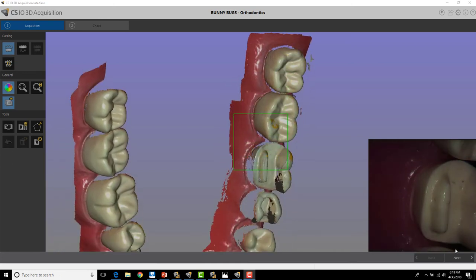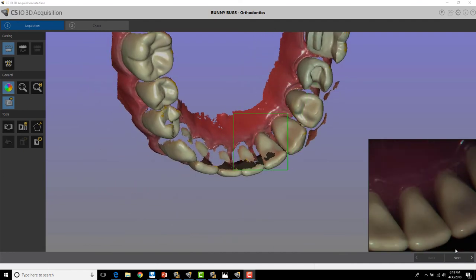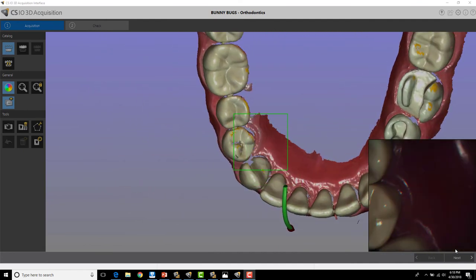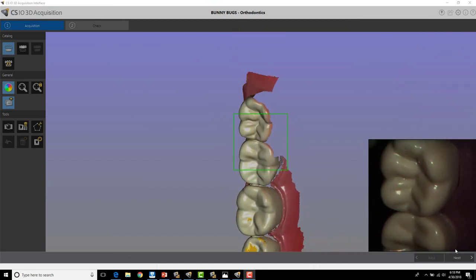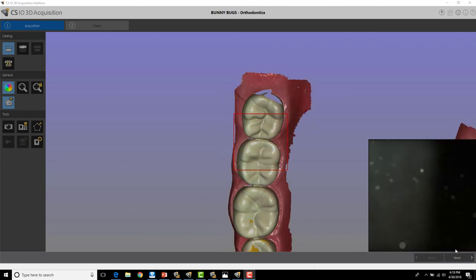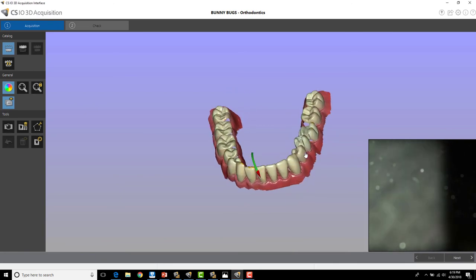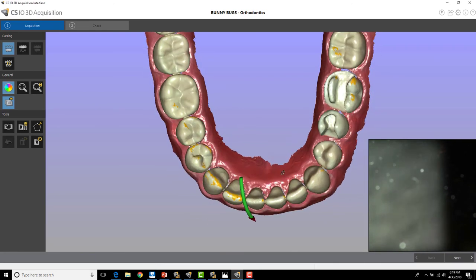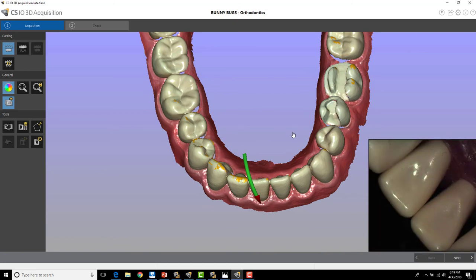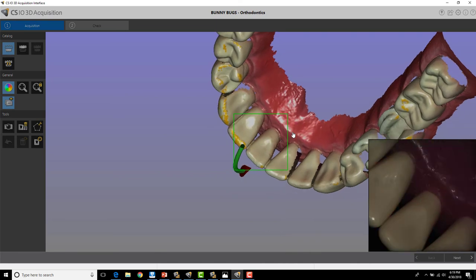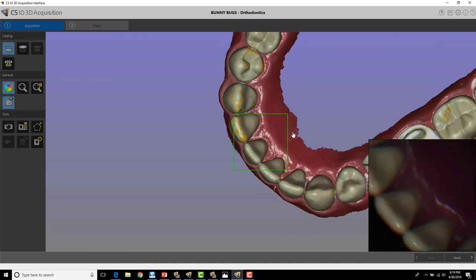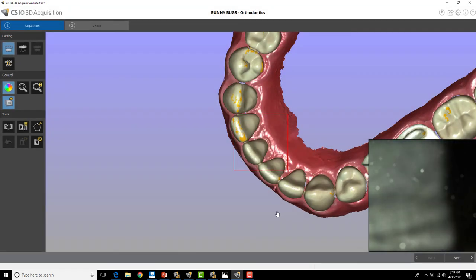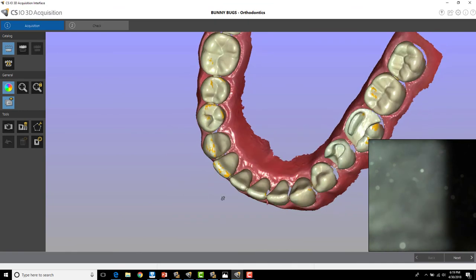And work my way around to the lingual. You might still get an arrow or two, but at least you're not getting six or seven arrows. Very easy to clean up. And you'll notice when I zoom in, even as it is, the incisal edge is really nice and smooth and clean. And if I wanted to clean up that one last arrow, I can do so. So I'm just going to roll from the lingual to the buckle in that particular area. That cleans up the incisal edge even better. Gets rid of my arrow. And now you can see when I zoom in again, you'll see everything is nice and smooth and crisp. And I'm ready to go.